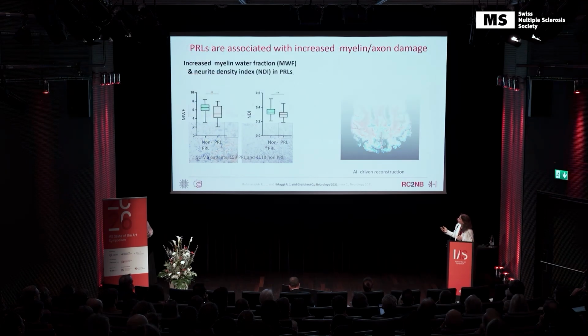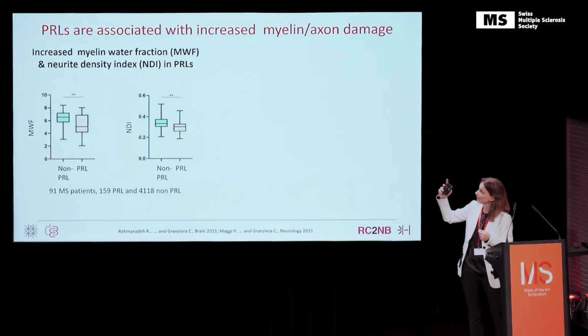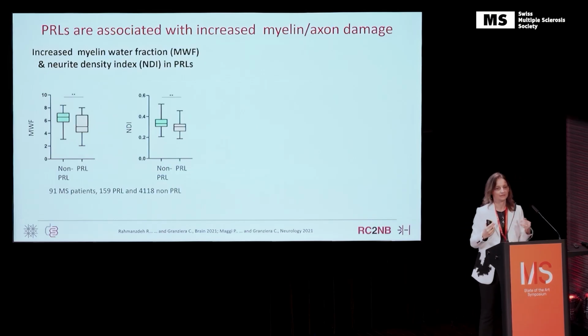And then if you go to the quantification, which we can do, using the same parameters that I told you before, myelin water fraction, which is a surrogate marker for myelin, and NDI, which is a surrogate marker for axon. You see that these lesions that we call nicely pearls have less myelin-related and less axon-related quantity compared to the other lesions. This is a fact.